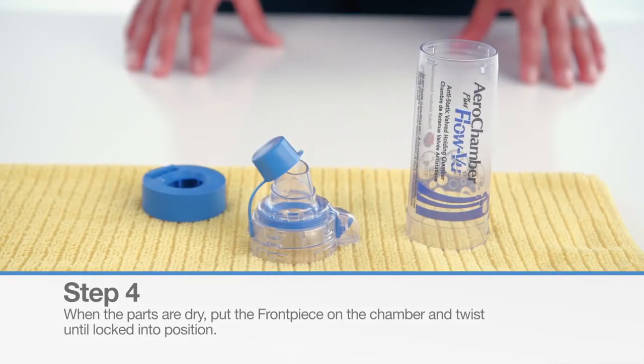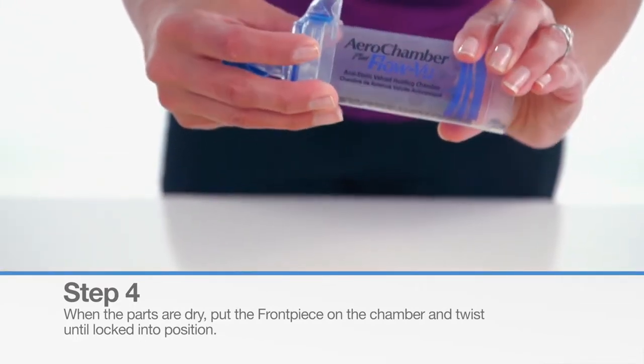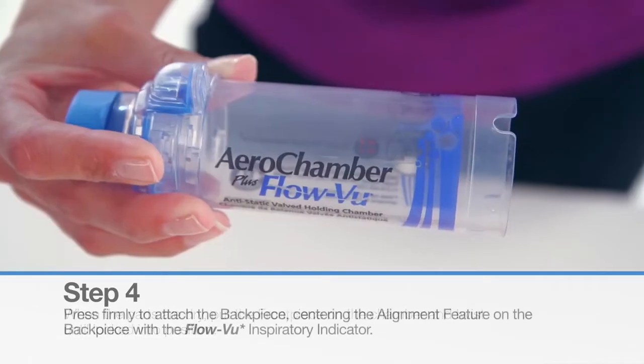When the parts are dry, align the front piece of the chamber and twist until locked into position. For mouthpiece models, the protective cap should always be placed on the mouthpiece when the chamber is not in use.